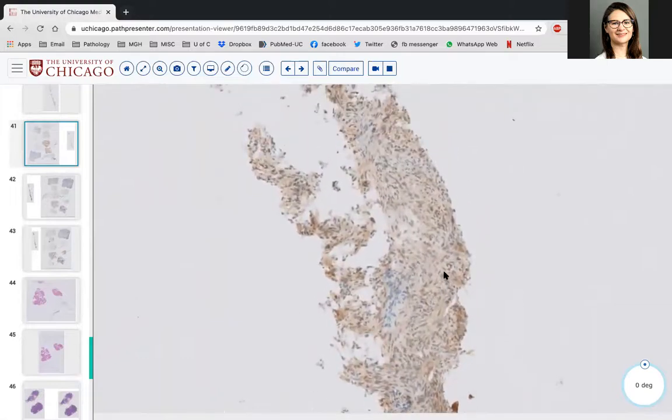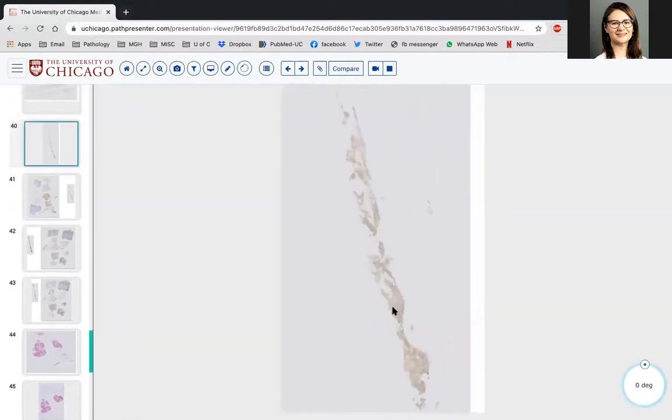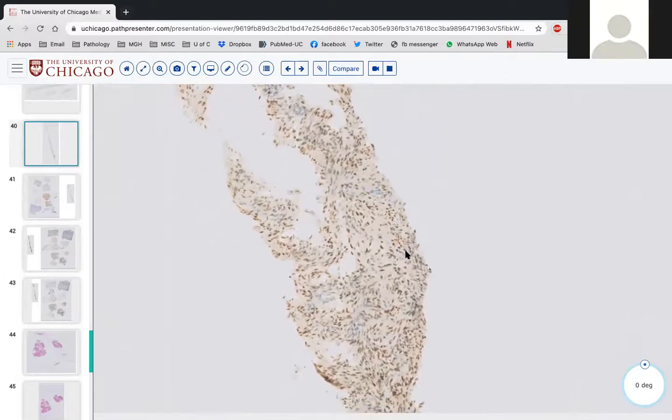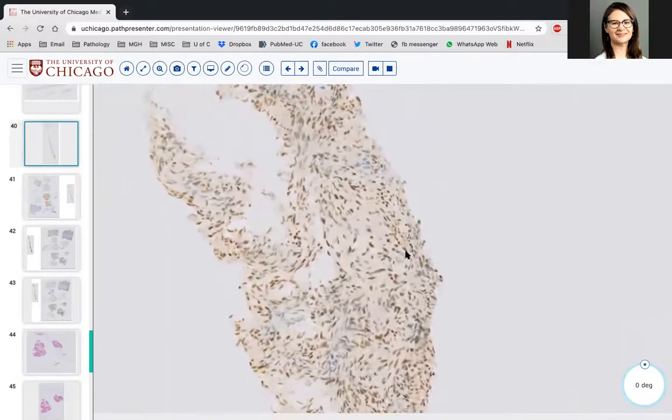So in the salivary gland, what does the combination of so-called melanoma markers like S100 and SOX10 and smooth muscle markers like calponin put you back at? So myoepithelial something. Myoepithelial would be a salivary gland tumor that would do that exactly. However, when you have something that is quote unquote melanoma, like S100 and SOX10, then what else do you want to think about, especially if it's spindled? Well, melanoma. Okay, and? Something like a neurofibroma or schwannoma. Okay, like a nerve sheath tumor, exactly.